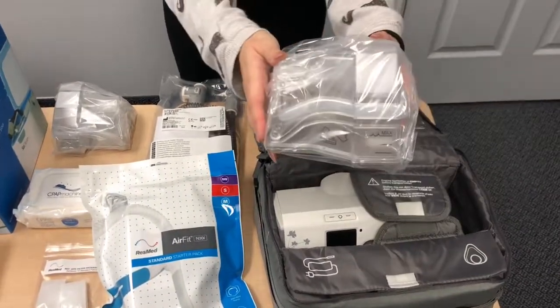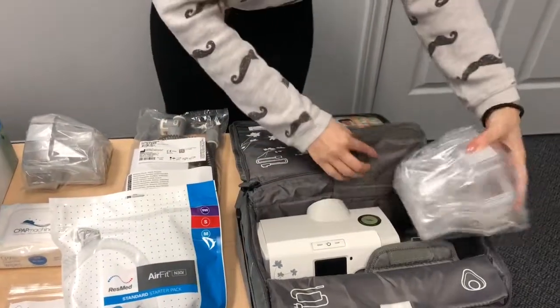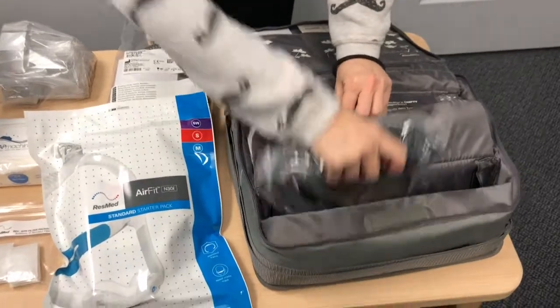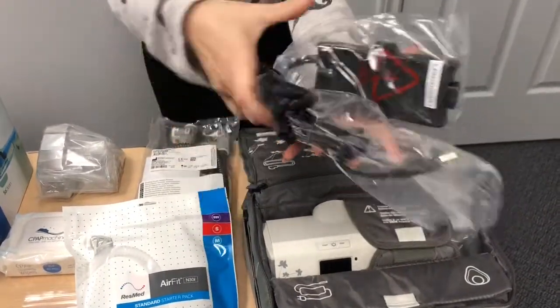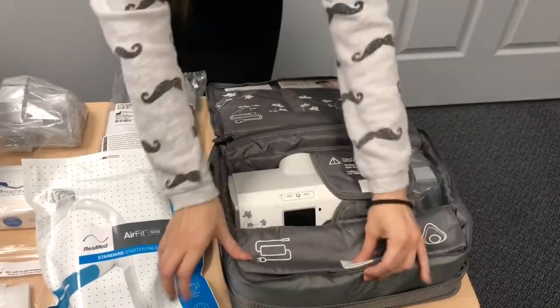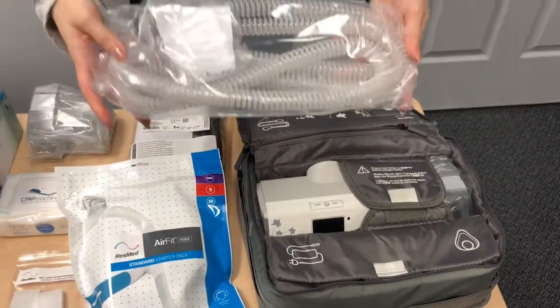the water chamber that goes to the side, the power supply and the power cord, as well as the standard tubing.